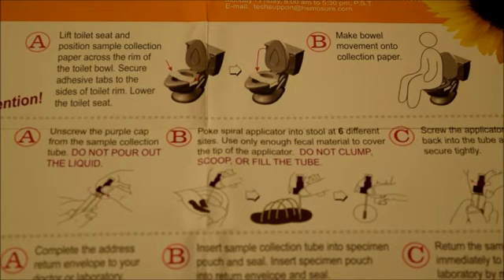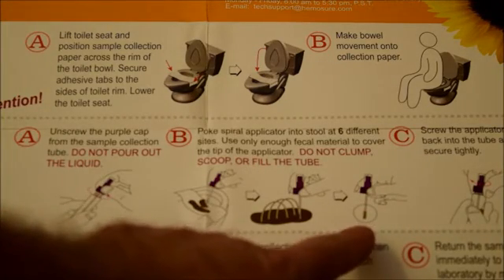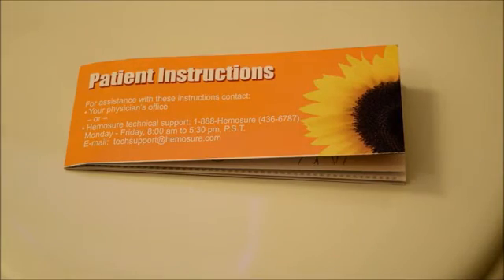All of the steps we've just gone over are included in your instruction sheet, but I want one more time to draw your attention to the fact that we do not want you to clump, scoop, or fill the tube. If you look at this photograph, all that is required is enough sample to cover the ridges on the end of the probe.